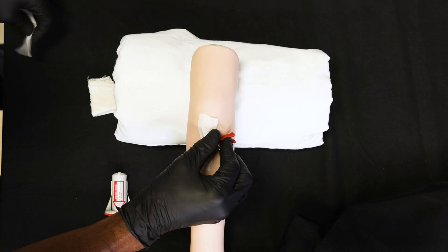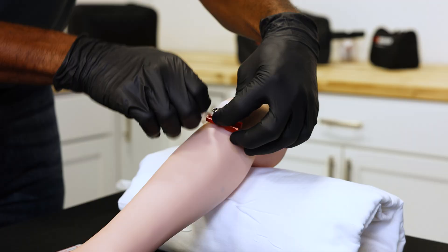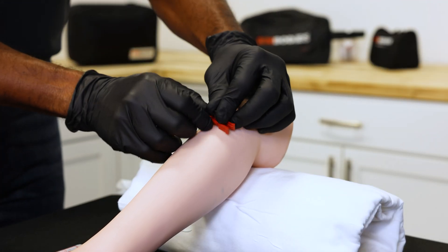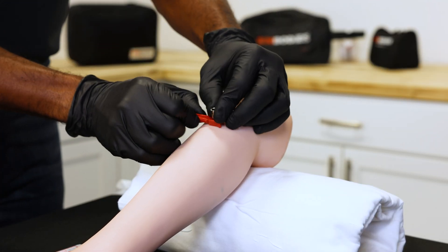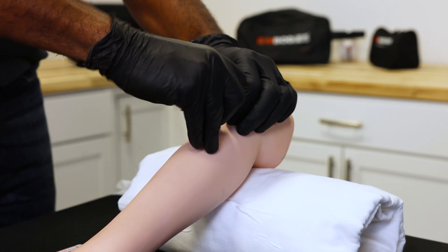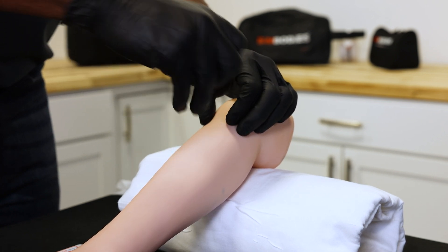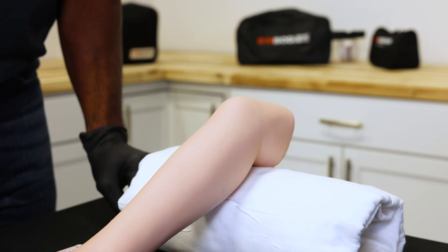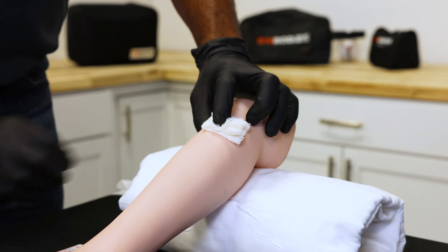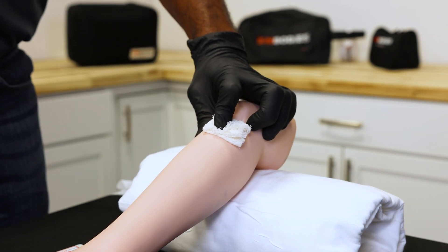To remove the Big P, remove the medical tape and the red safety latch while stabilizing the needle with your fingers. Then firmly grasp the needle and twist while pulling up until it is removed from the insertion site. Once removed, hold pressure on the site until hemostasis is achieved.